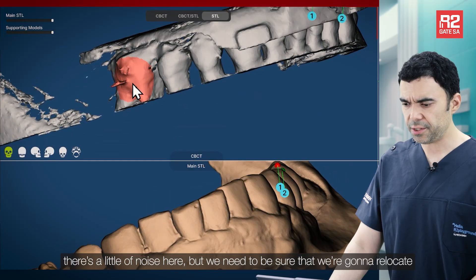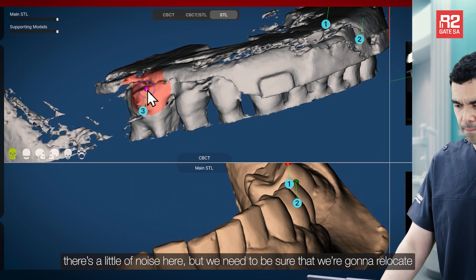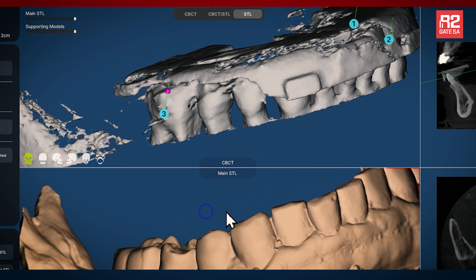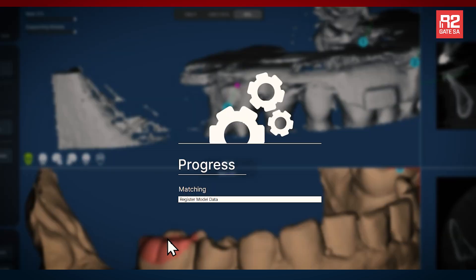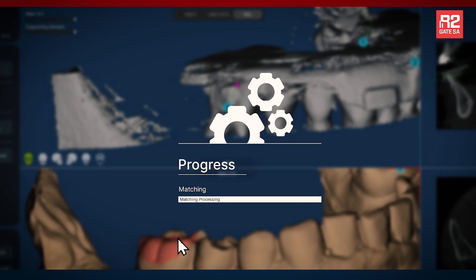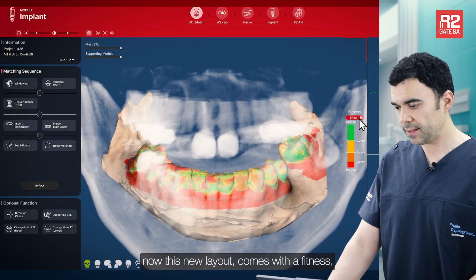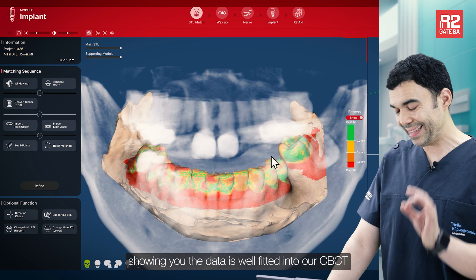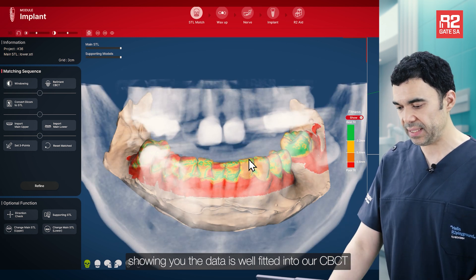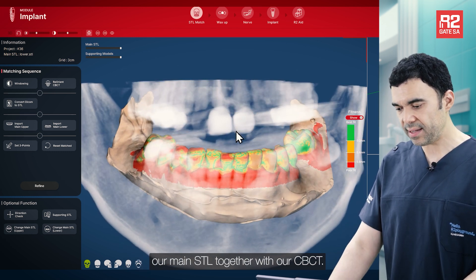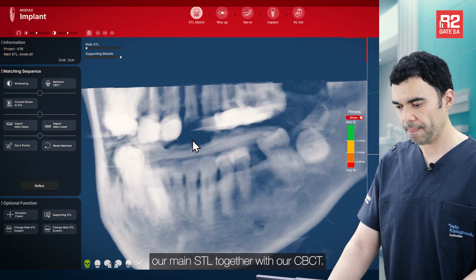There is a little bit of noise here, but we need to be sure that we are going to relocate. This new layout comes with a fitness score showing you the data is well-fitted into our CBCT. Our main STL together with the CBCT. Thank you.